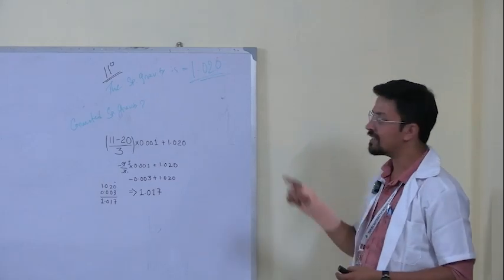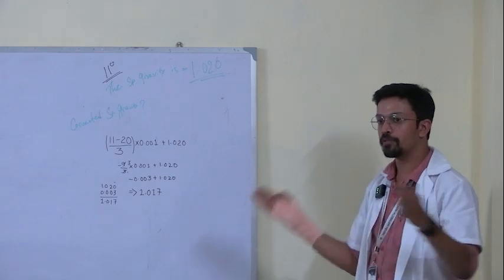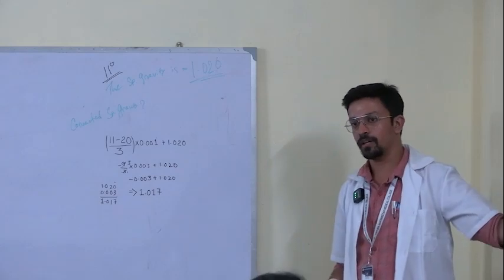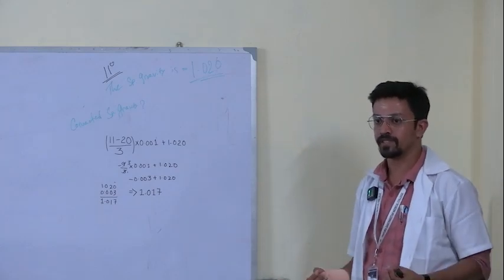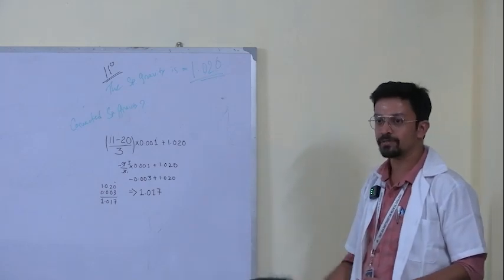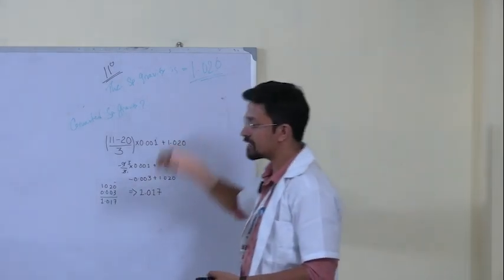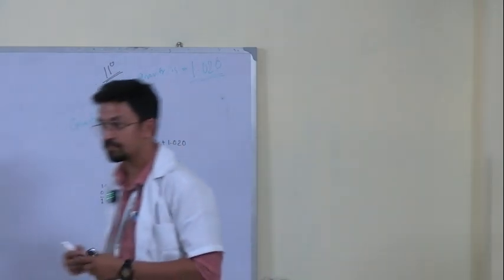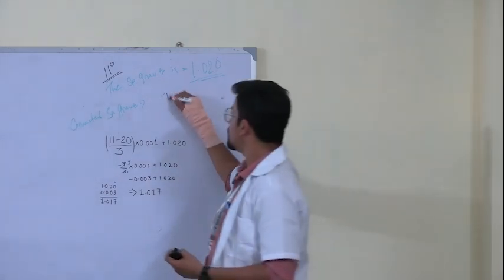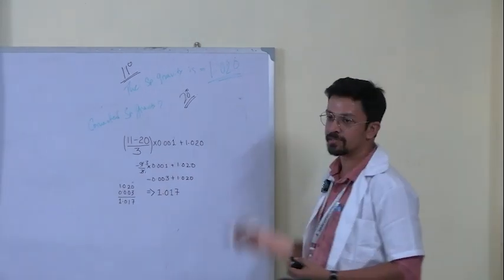So for that reason, we take the medium temperature as 20 degrees. That is fixed everywhere. That is why we compare. Like you take a sample here, you measure it here, and you take a sample in Pune. The temperature is different in both places. You cannot change the weather completely. You can change the environment inside the lab, but not the whole area. So that is why we take the temperature as 20 degrees. That is the base temperature. Everything has to be measured at 20 degrees centigrade. Got it? That is the base temperature where you have to measure the specific gravity.